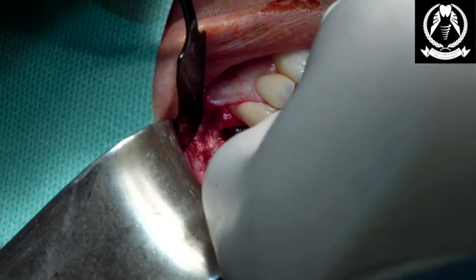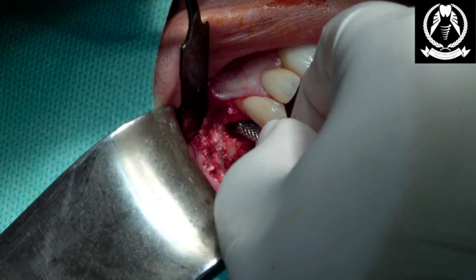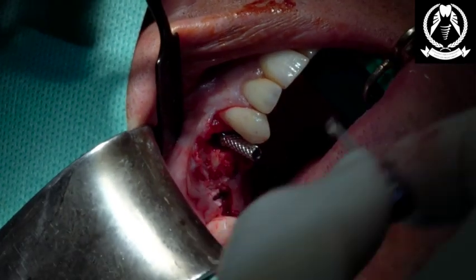Not opening much today. There we go. That's a clear shot there. Yeah, so just putting the temporary abutment on. I'm going to shave that down a little bit, all right? And then we're going to put another temporary on there.